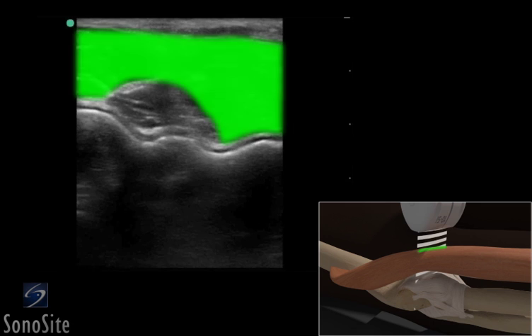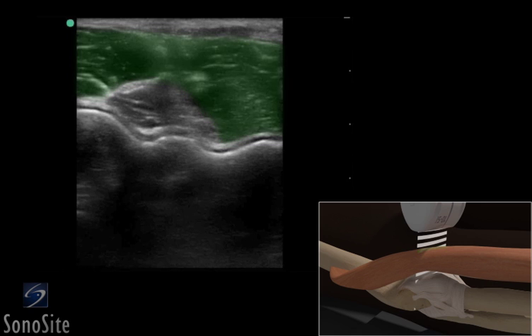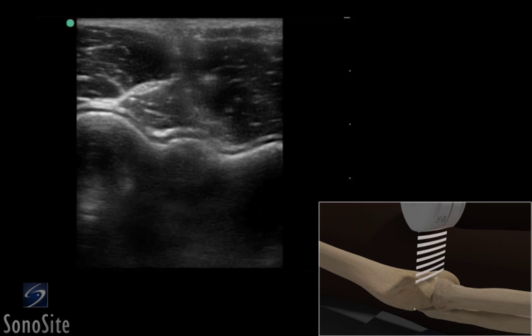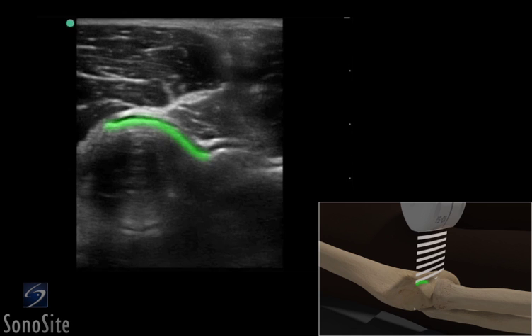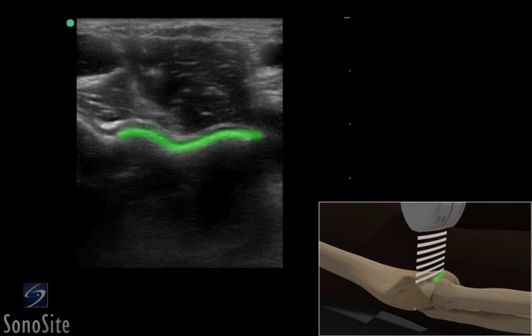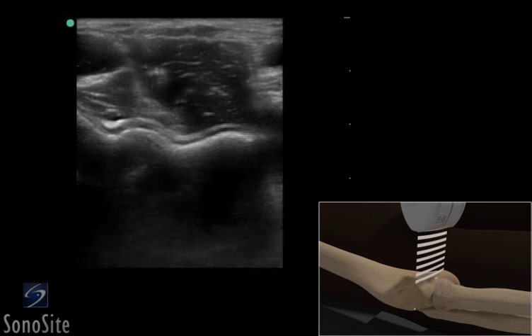The brachialis muscle is seen as a hypoechoic striated structure encompassing the hyperechoic brachialis tendon. The anterior distal humeral epiphysis appears as a bright hyperechoic wavy line with a thin overlying articular cartilage. The humeral capitellum is seen as a rounded structure laterally and the humeral trochlea appears as a v-shaped structure medially.